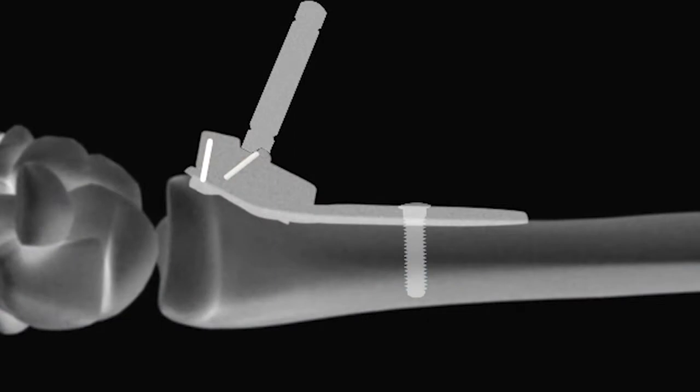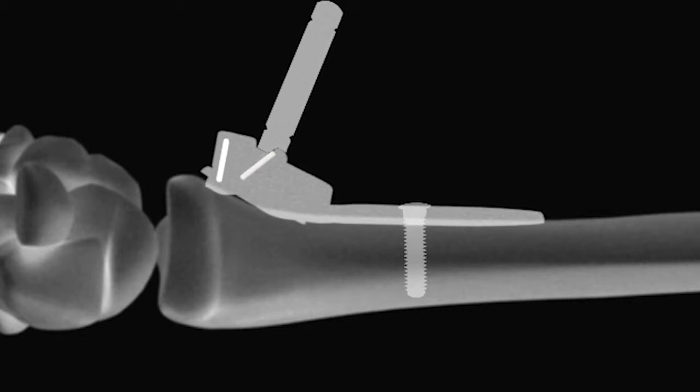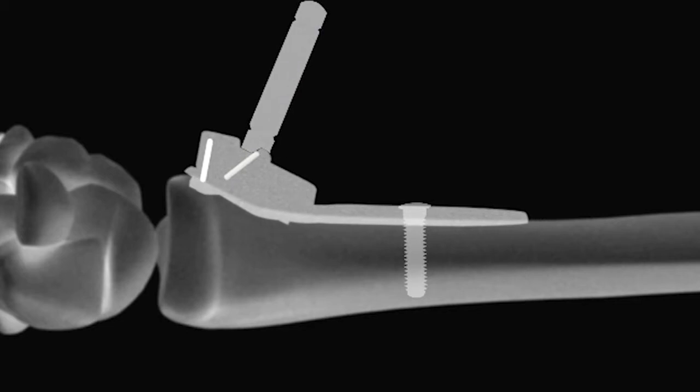Utilizing the radiopaque positioning posts in the targeting guide, the position of the plate relative to the radiocarpal articular surface can be fine-tuned by sliding the plate proximally or distally under fluoroscopy with or without the plate positioning handle. If the radiopaque posts don't target the joint, the distal 2.3 mm screws will not either. To further assess the position of the distal 2.3 mm screws relative to the radiocarpal articular surface, place an 054 K-wire through one of the K-wire holes in the targeting guide closest to the joint and assess its location under fluoroscopy.